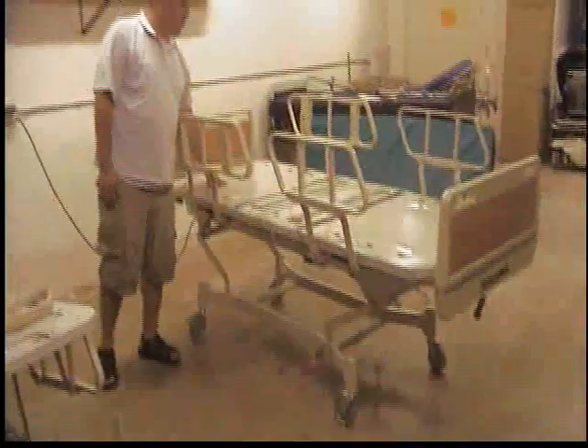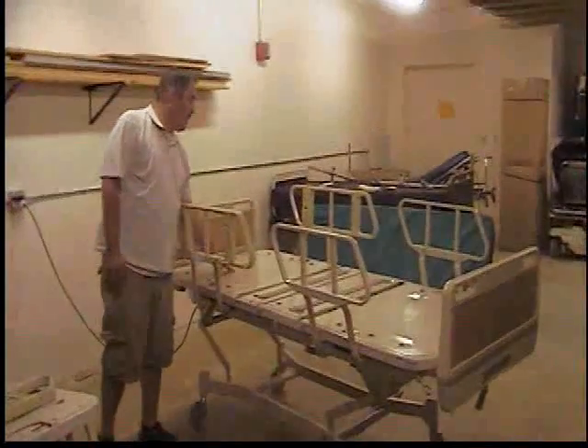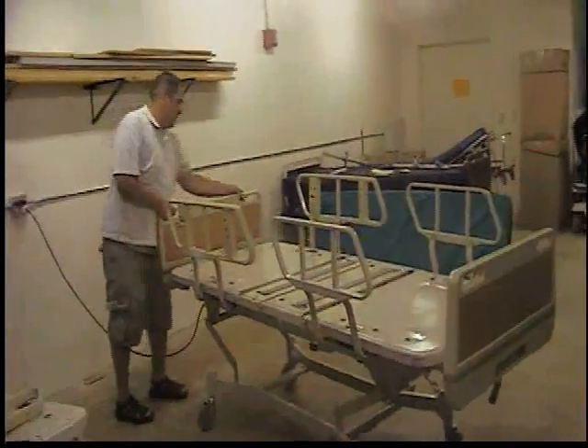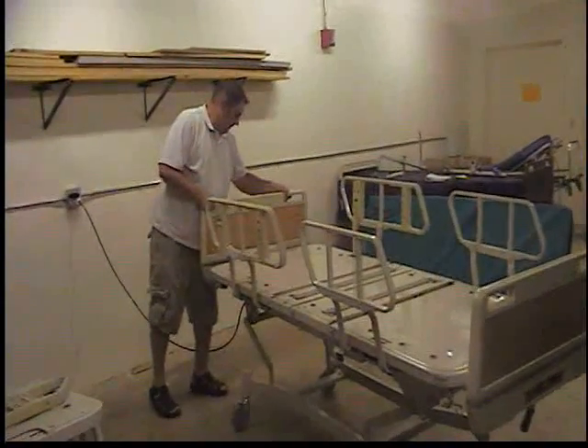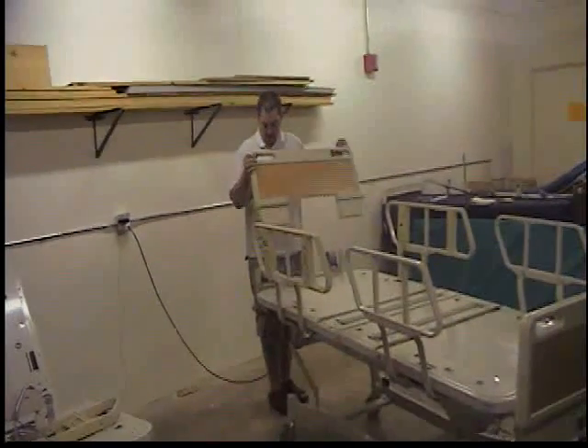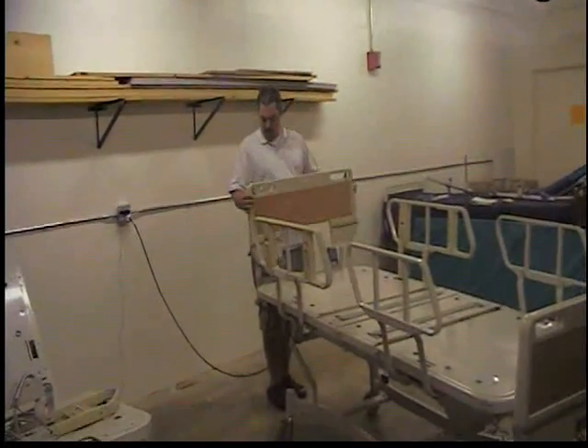It will ensure proper rotation. You just want to check the integrity of the bed. This bed is fairly clean and you want to check the headboard and the footboard just to make sure that they can come off. I want to unplug it and check the headboard and the footboard as they are here.